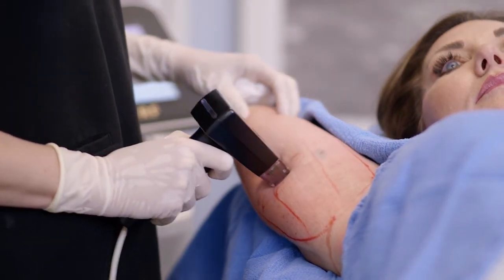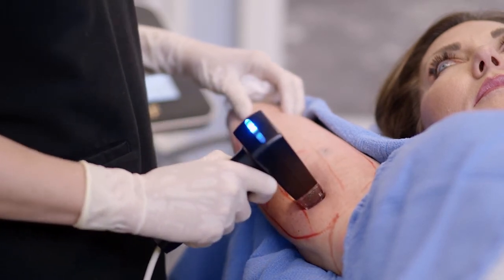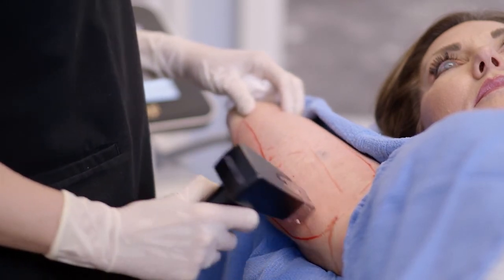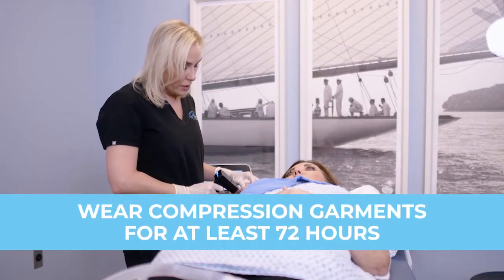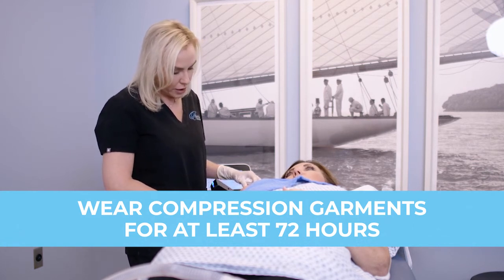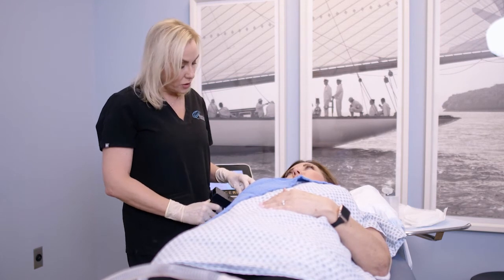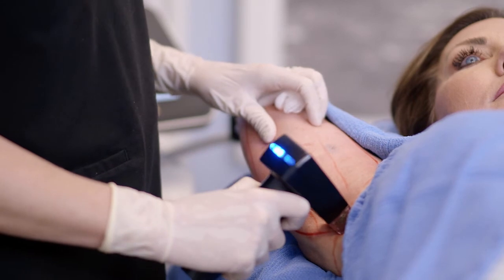What's also happening is that the body is now stimulating the fibroblasts to respond to the damage to the collagen, and the fibroblasts rebuild the collagen to support the structure of the skin. We do like for you to wear compression garments on this, so we'll wrap your arms for you and give you a garment that you can wear as much as you can for at least the first 72 hours. That will help to push some fluid out, but it'll also help that skin to really contract as well.